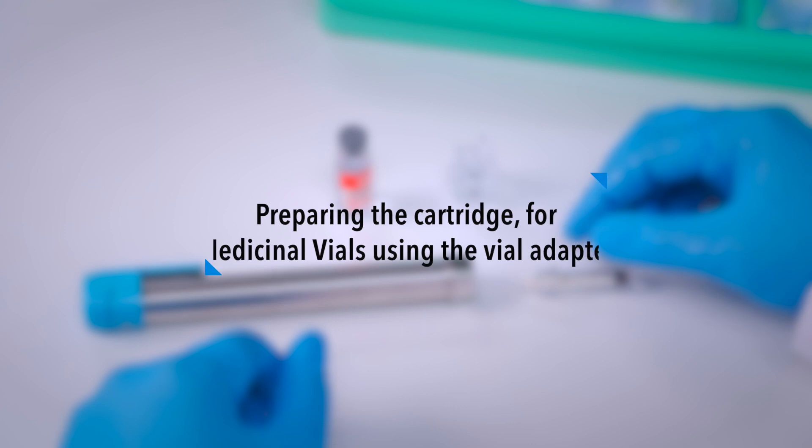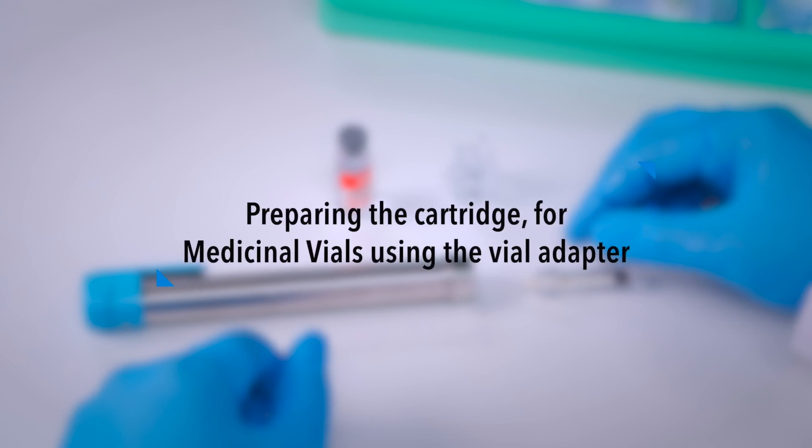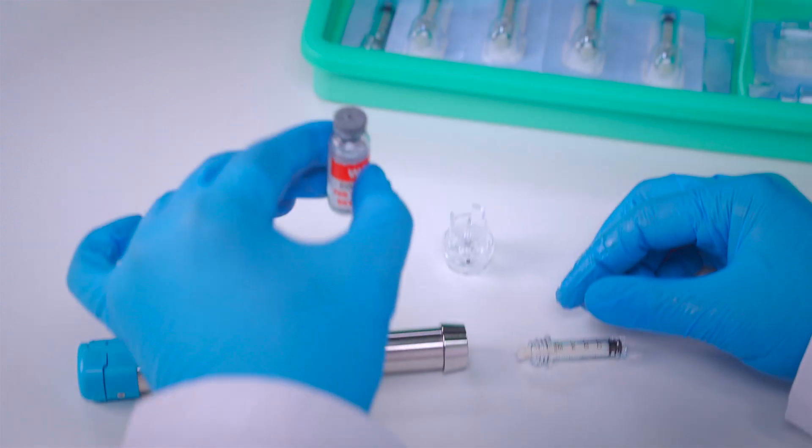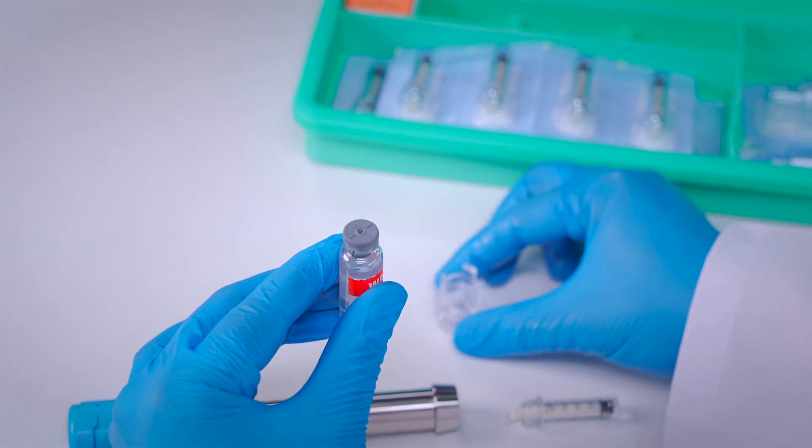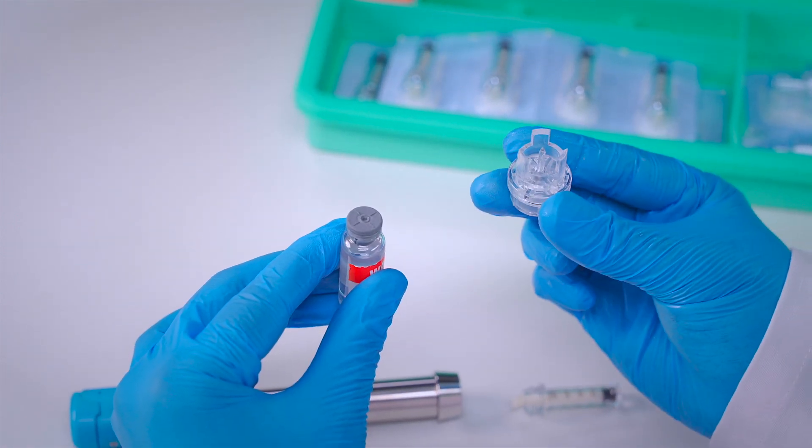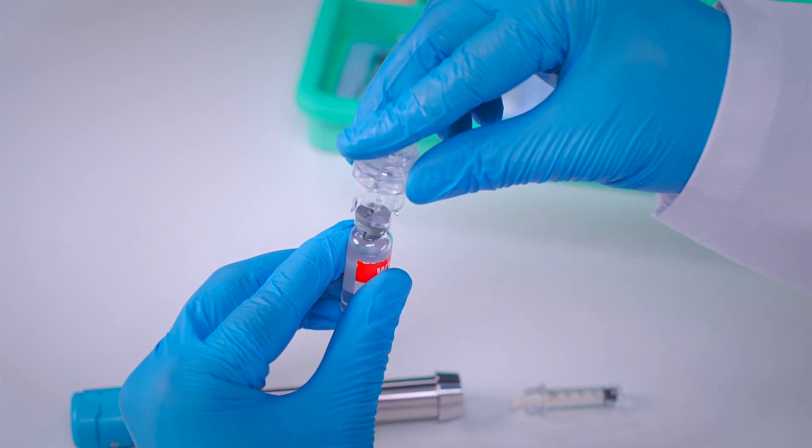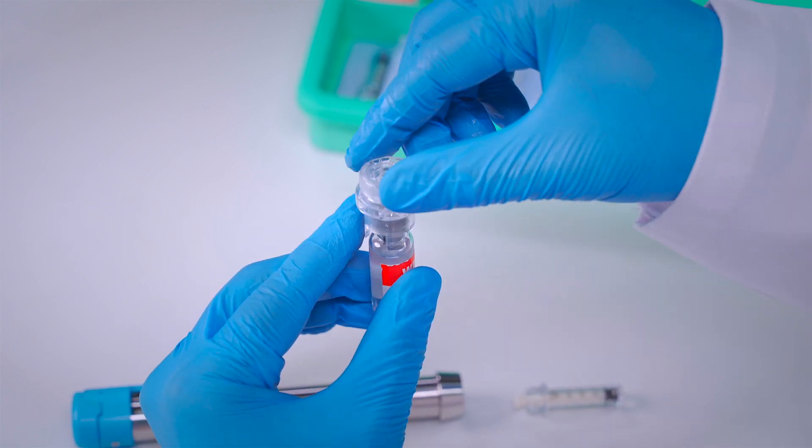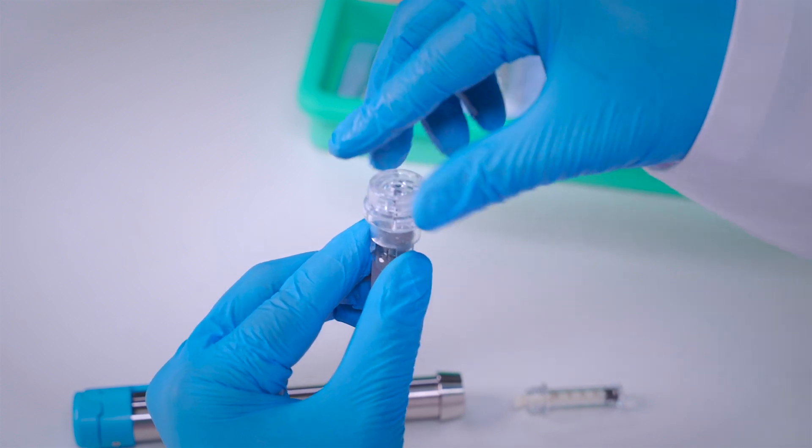Preparing the cartridge for medicinal vials using the vial adapter. In the case of medicinal vials, insert the vial adapter spike into the center of the vial. Remove the safety cap from the other end by turning counter clockwise.